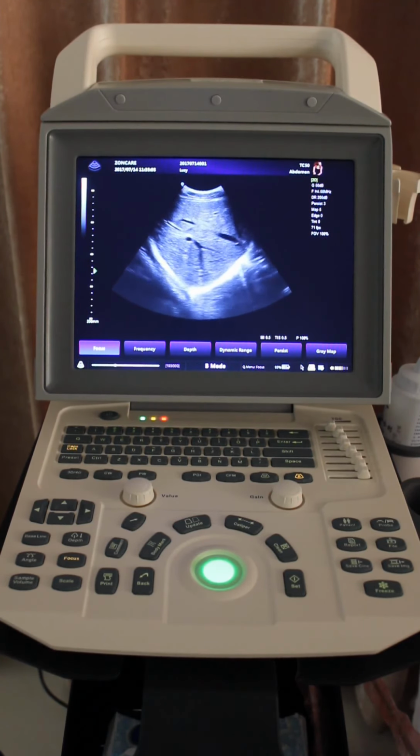Press the value button. Then we can see there is auto track. Auto track, we can try to open it. Having the auto track, we can see there is a very important auto measurement result here. This is very important. Then we can close the auto track.